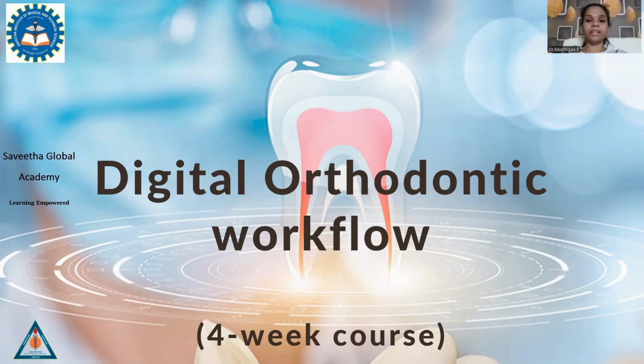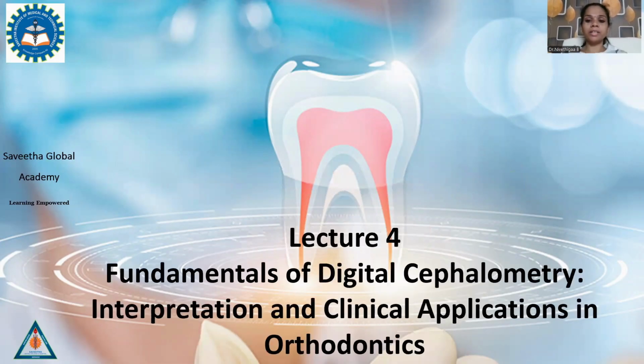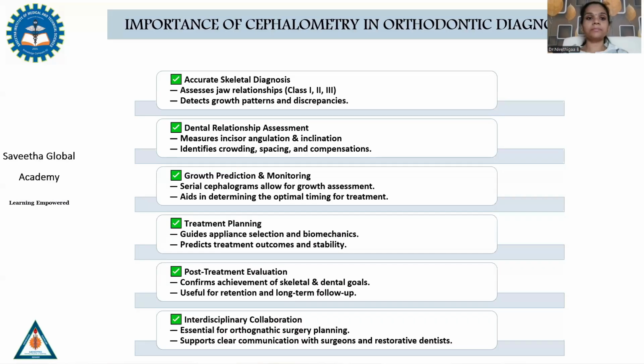In this part of the lecture, we'll be seeing about the fundamentals of digital cephalometry, interpretation, and clinical applications in orthodontics. So let us first know what is the importance of cephalometry in orthodontic diagnosis. It provides an accurate skeletal diagnosis for the patient in assessing class 1, class 2, class 3 skeletal malocclusions and to detect any differences in growth patterns and discrepancies.